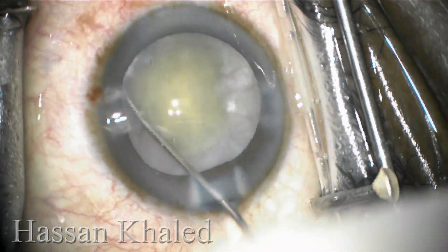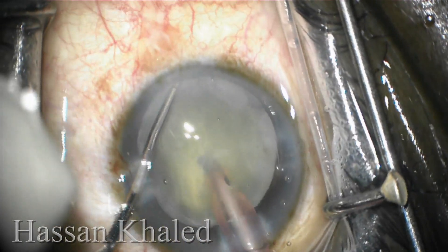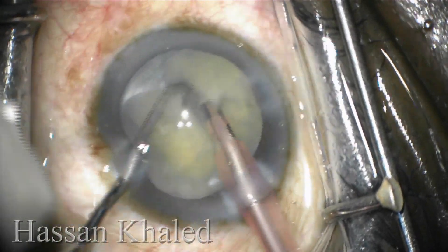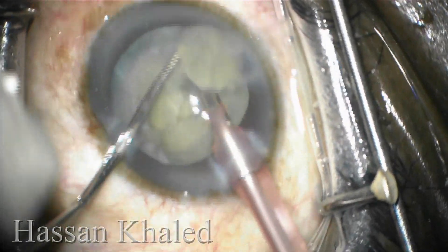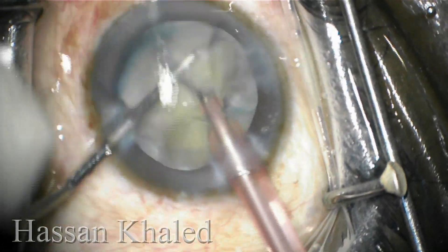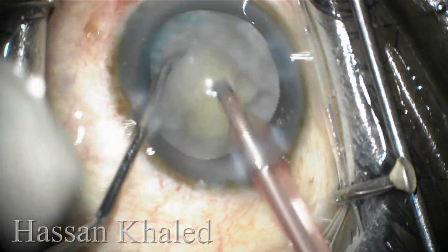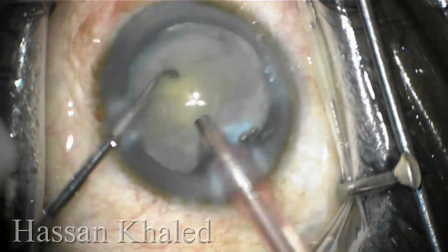Now rotating the nucleus inside the capsule — here is the horizontal chop technique. I impale the phaco tip in the nucleus and do a complete separation into halves. Then chopping each half into smaller pieces and emulsifying as usual.